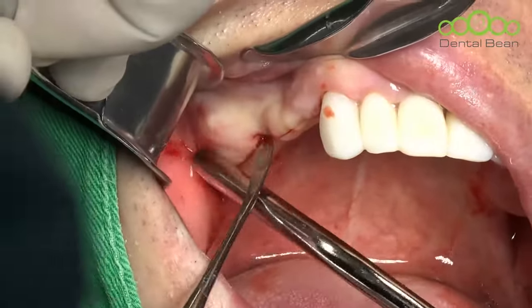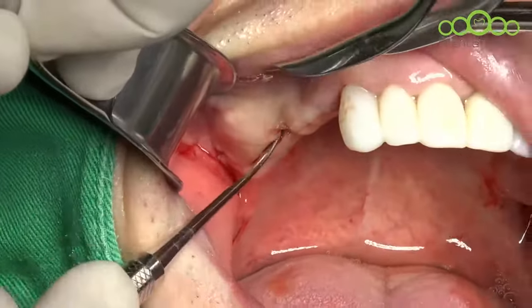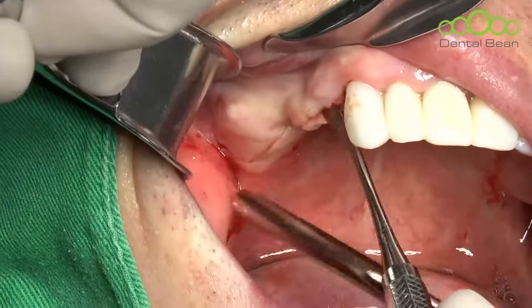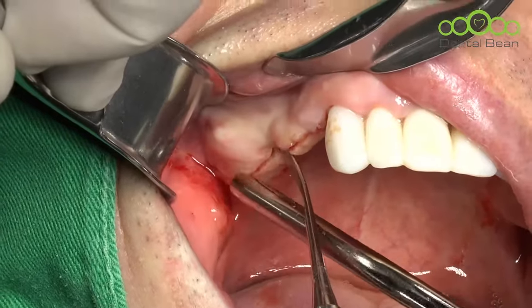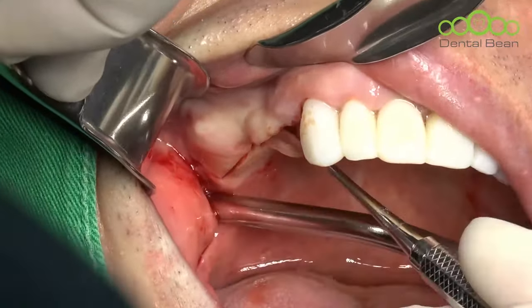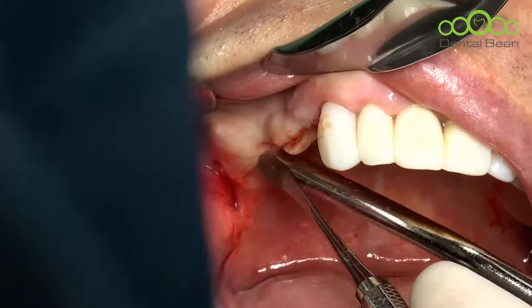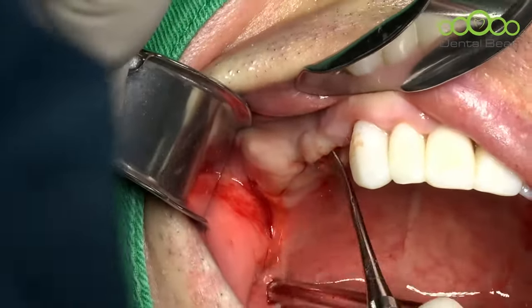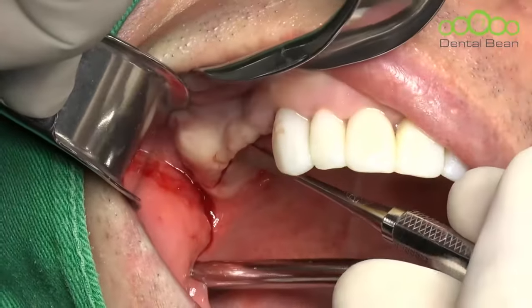This is a temporization, provisional restoration. When the patient wears a temporary denture, it is usually difficult to elevate the flap because of the adhesion. So I must be careful not to tear the flap. There's some adhesion, so it's not so easy to elevate.